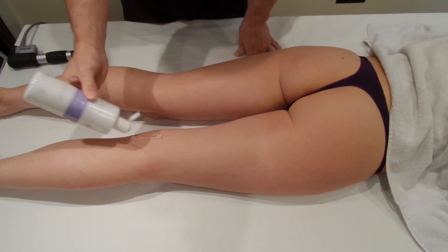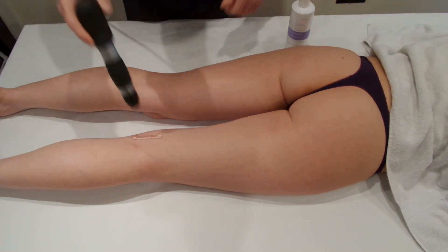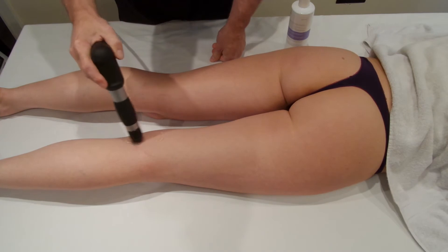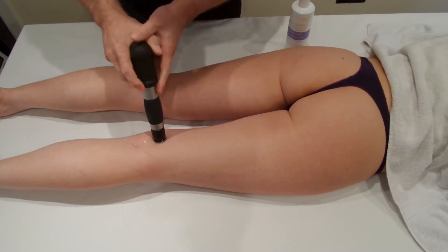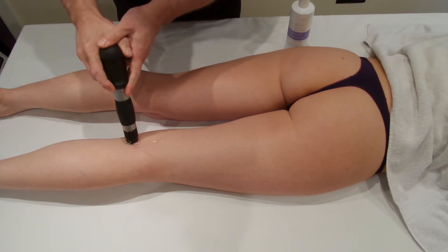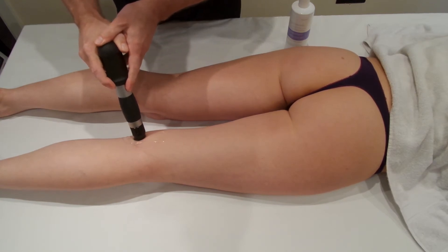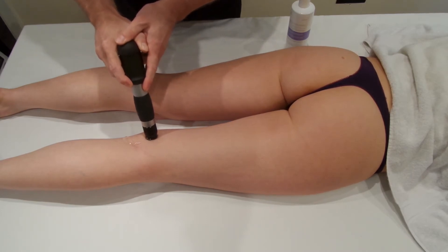Apply some gel to the hamstring tendon. This will be a moving technique — we're moving up and down the hamstring tendons, trying to give an equal amount of shocks to each area. Start by applying the shocks at one part of the hamstring tendon and then moving across.